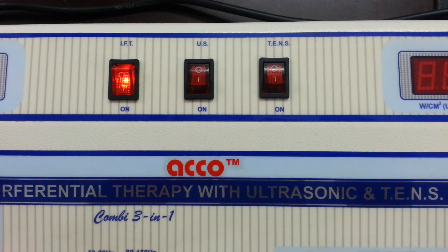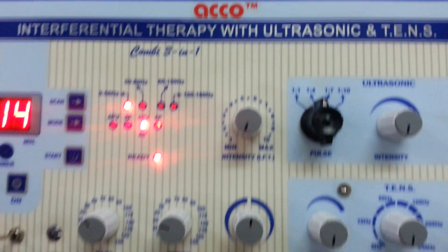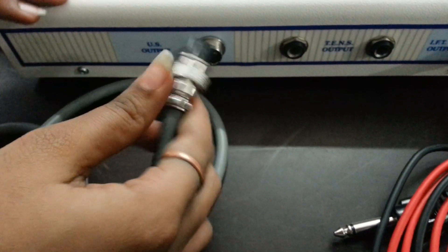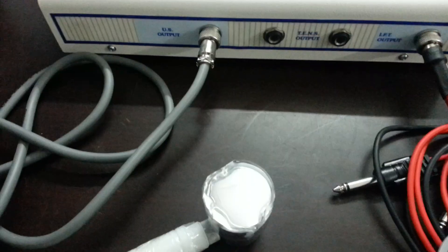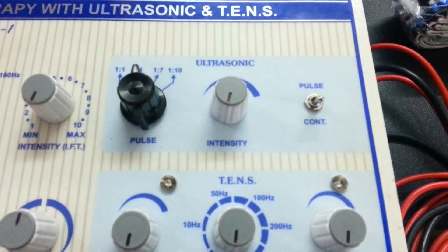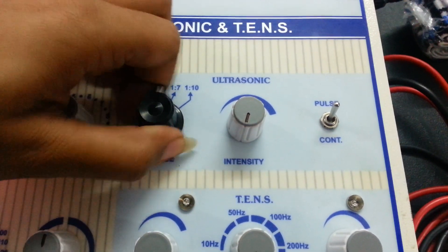And now we will show you the demo of the ultrasound therapy unit. Switch on the ultrasound machine. Attach the handle and wire. Now set the mode as per your requirement — pulse or continuous. If you select the pulse mode, set the pulse ratio as per your need.